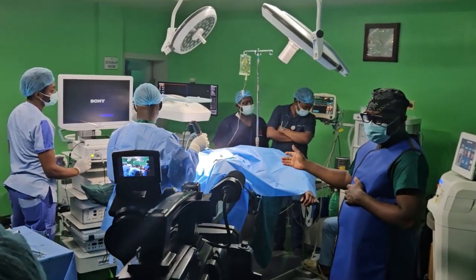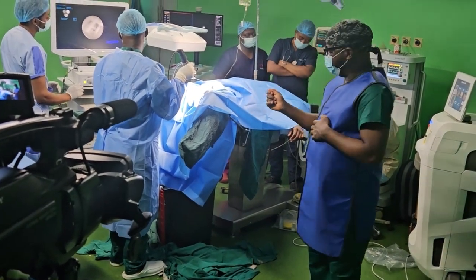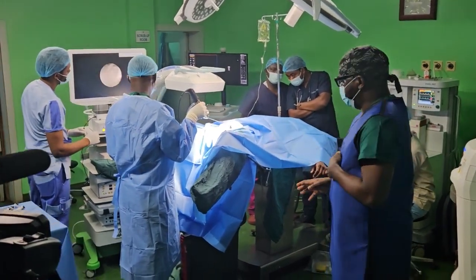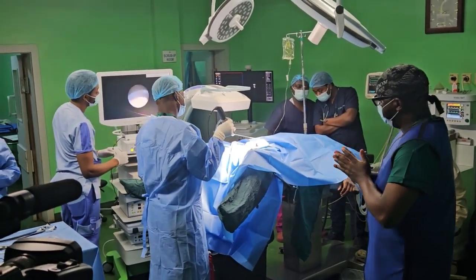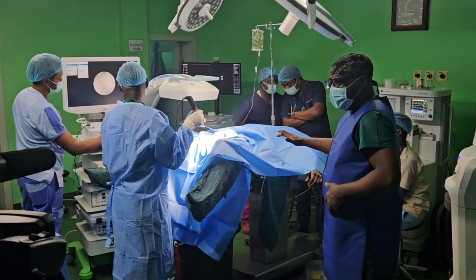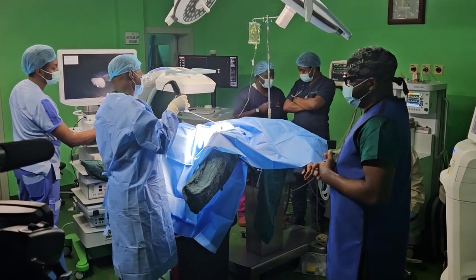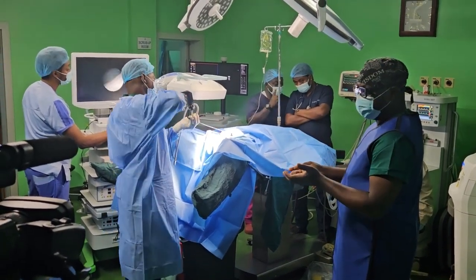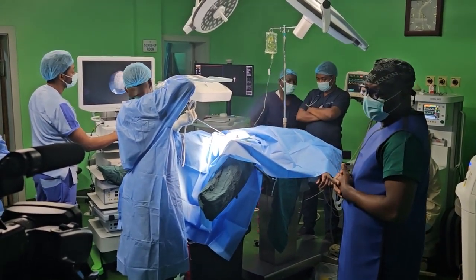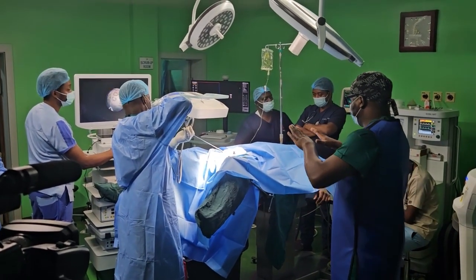So it's a pre-stented patient. We will remove the DJ stent, place our guide wire, and put the ureteric catheter over it, anchor it to the urethral catheter, and then return the patient prone. So I am doing a bolsterless procedure. At the initial stage of our procedures, we were using bolsters. Now we don't use bolsters, and we are usually very fine.